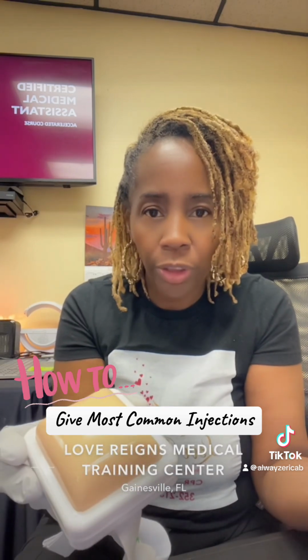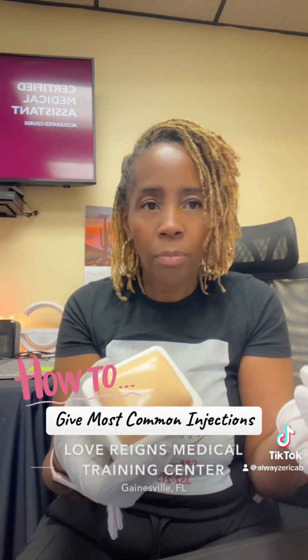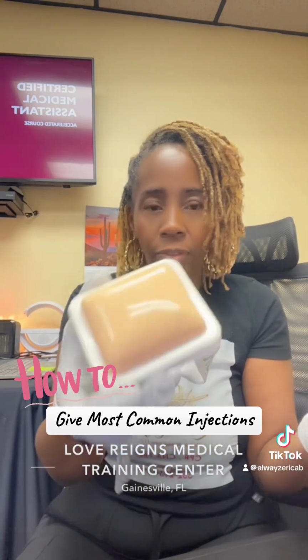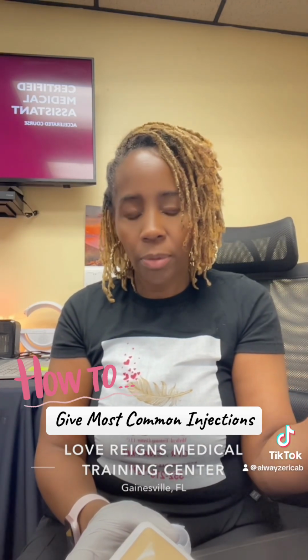That bubble is called a wheal, W-H-E-A-L. That is what we're going to monitor for 72 hours to see if you are positive or negative for tuberculosis. They want to know, have you had any exposure to TB, and that's what we're checking for, okay? Once you're done with that, that will be discarded. This does not have an activation device on it either. It needs to go straight into the sharps container, okay?